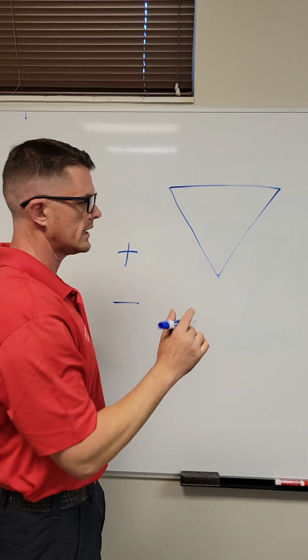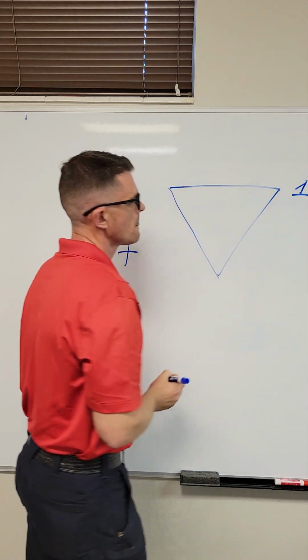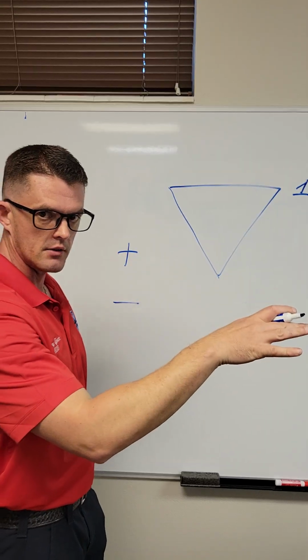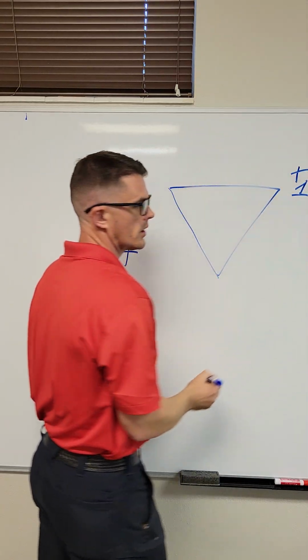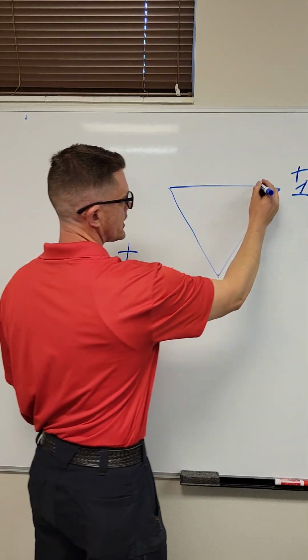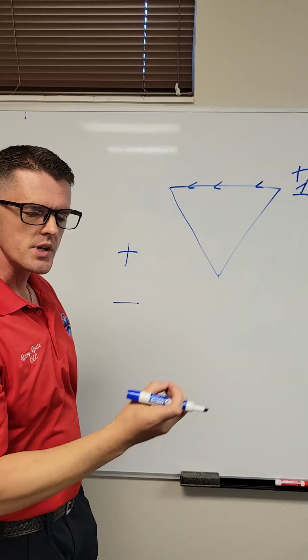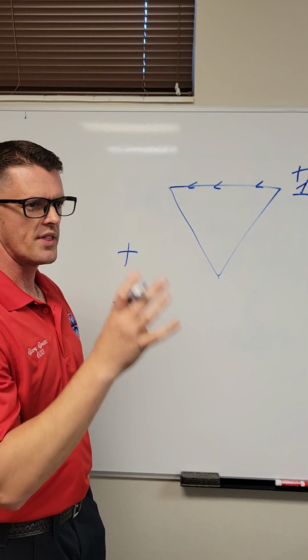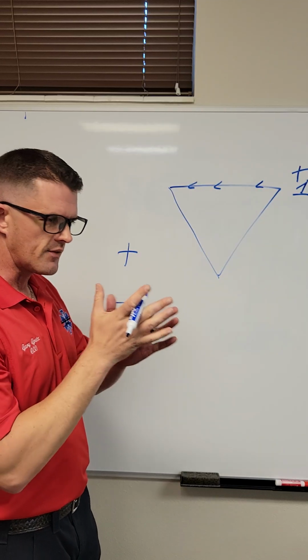So what I mean is, take lead 1, for example. We put lead 1 here, okay? Now lead 1, think of that as the positive. It's looking. So then we'll put positive here, okay? And if 1 is looking in this direction, well, it needs something to focus on, okay? And technically you can run EKGs without negatives, but it's very distorted.